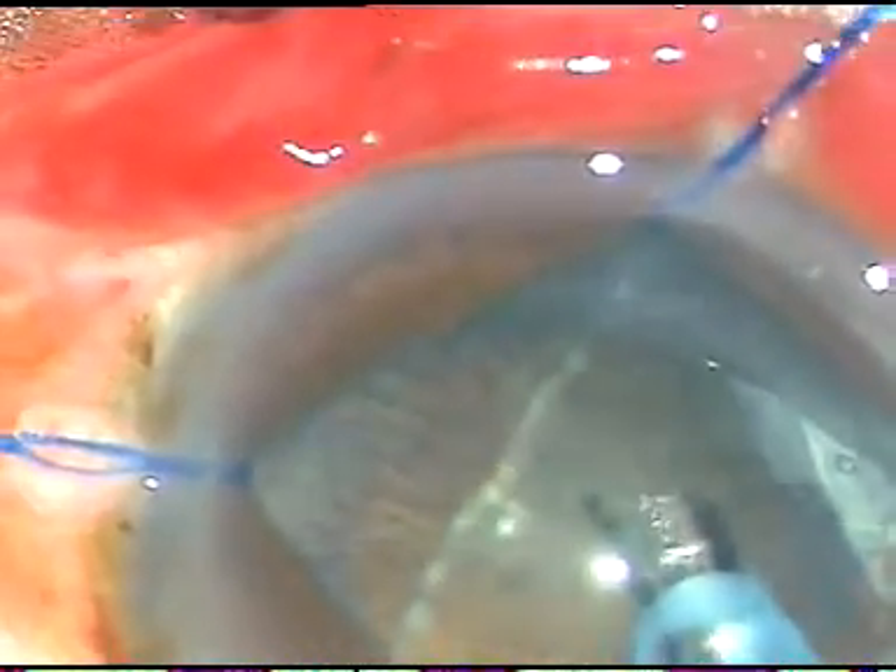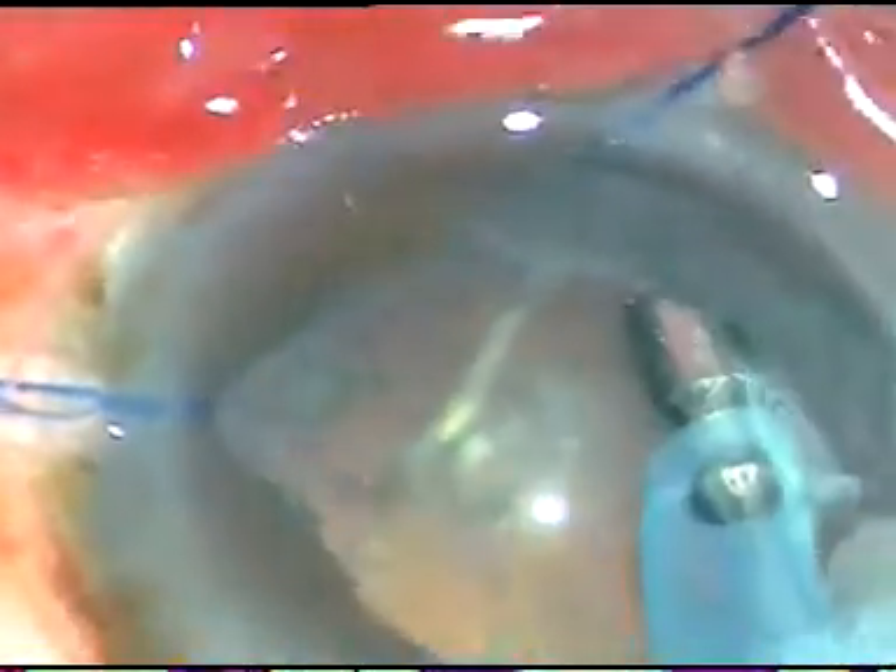Now see how I remove the epinucleus. I turn the tip, hold the epinucleus, and move it forward. I have to struggle for some time to mobilize the epinucleus. I use only vacuum and no power to hold the epinucleus. It turns and comes to the center of the chamber. I use a little bit of energy and remove it.